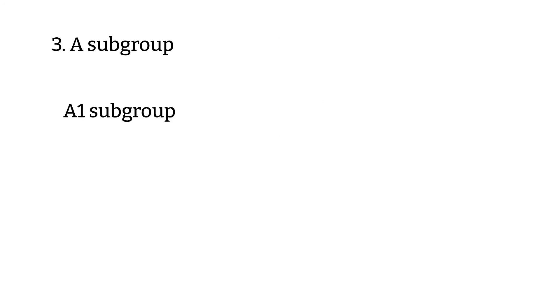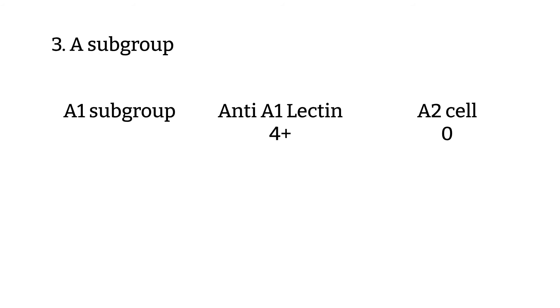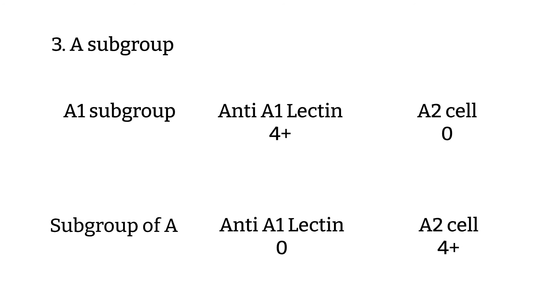You can also have an A-subgroup patient. You can confirm this by performing anti-A1-lectin and A2 cells. If the patient is A1 subgroup, then your anti-A1-lectin should show 4+ and A2 cell should be 0, or non-reactive. If your anti-A1-lectin is non-reactive and A2 cells is 4+, then you can report it out as a subgroup of A.